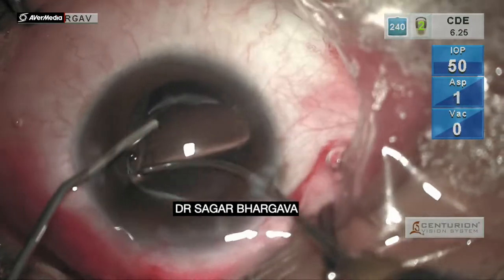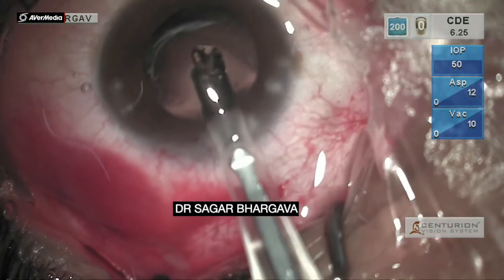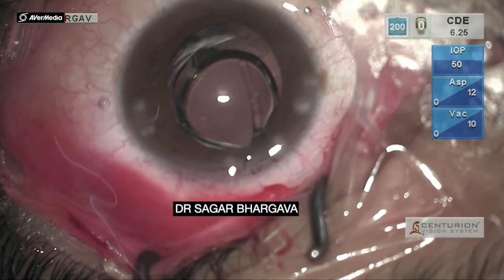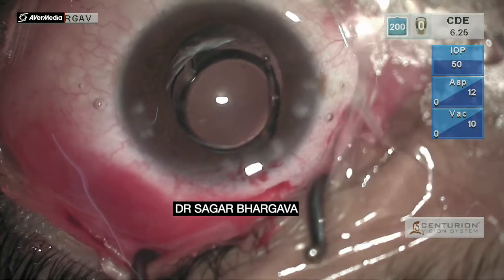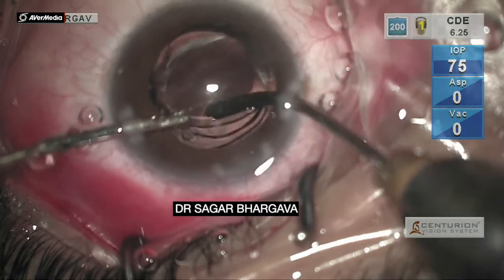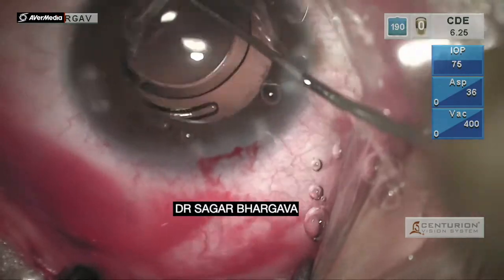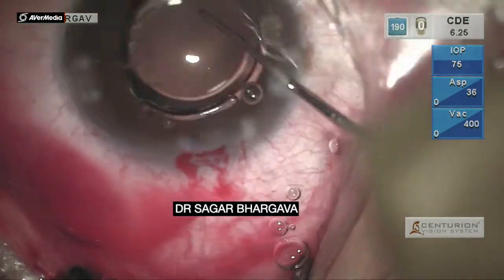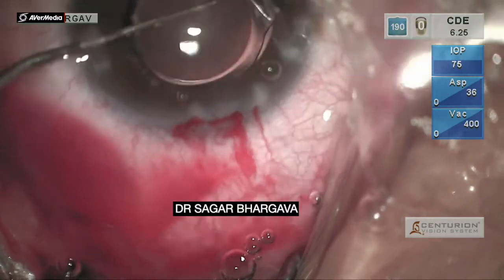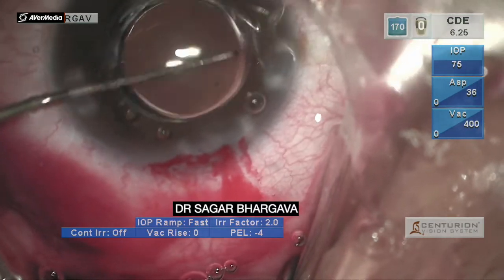Subsequently, posterior capsular polishing is done. A monofocal single-piece aspheric lens is implanted in the eye. The leading haptic goes directly into the bag. The lens has to be tucked in the back so that it maintains centration and stability. It needs a little rotation and micromovements to get the lens exactly in the bag. At one particular point, with small rotations, it finally goes in completely and we get a very centralized position of the IOL.